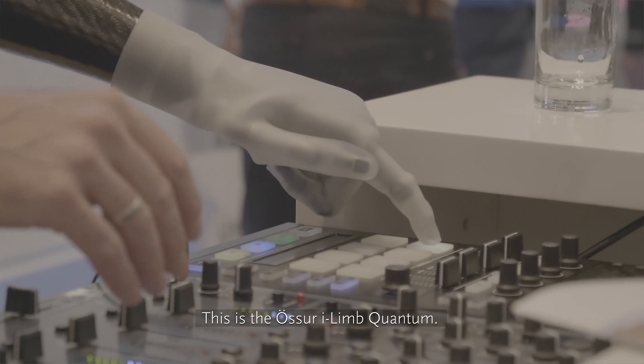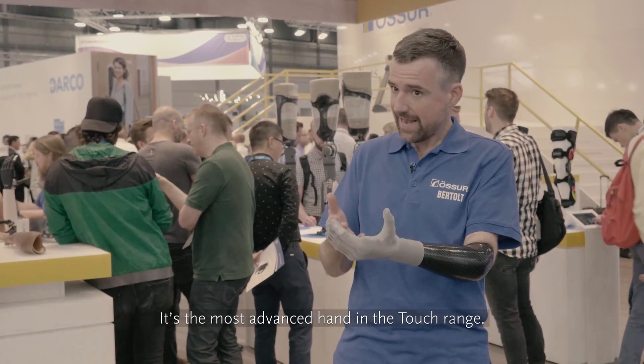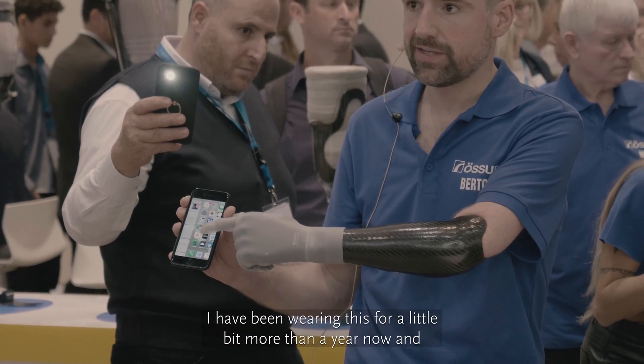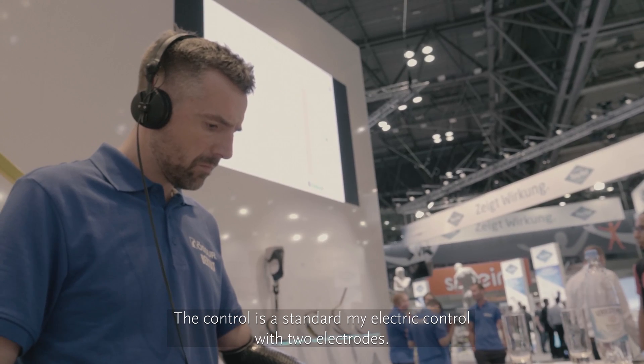This is the Össur i-Limb Quantum — it's the most advanced hand in the Touch range. I've been wearing this for a little more than a year now. The control is a standard myoelectric control with two electrodes.